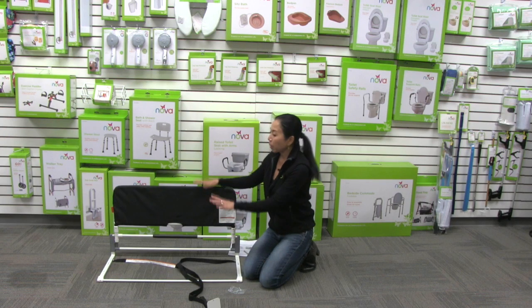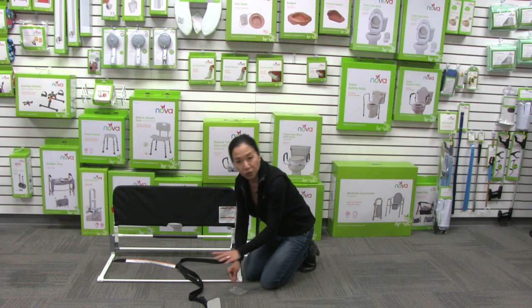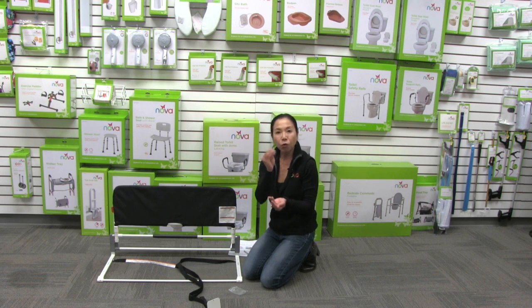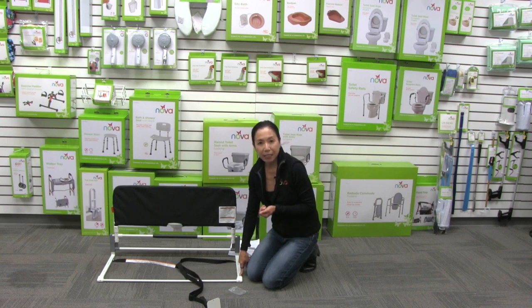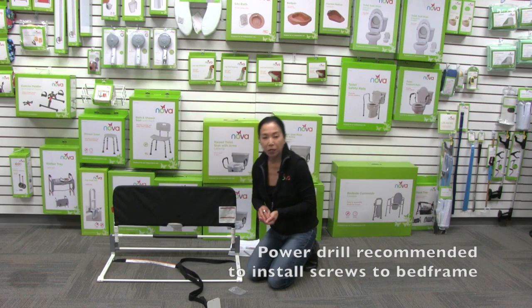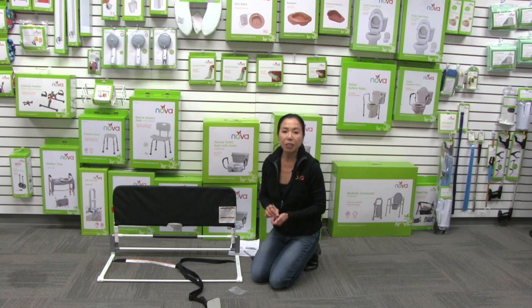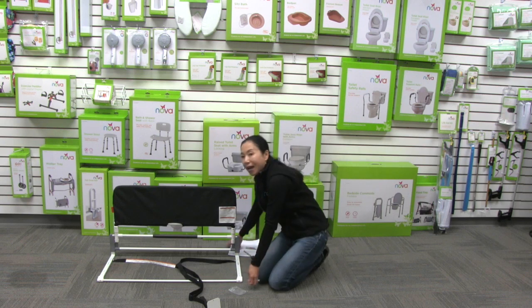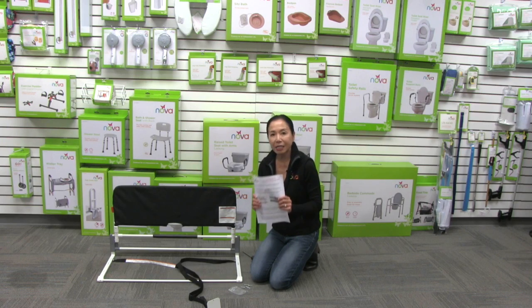Once your bed rail is fully assembled and attached to your bed, adjust the straps for your mattress size. The last step: you have four long screws included. We highly recommend that you permanently set the bed rail onto the bed frame. Depending on where you want to position the bed rail, take the screw, insert it through the bar, and attach it permanently to your bed. You can also reference how to put the bed rail together and all the safety guidelines in the guidebook that comes with your bed rail.